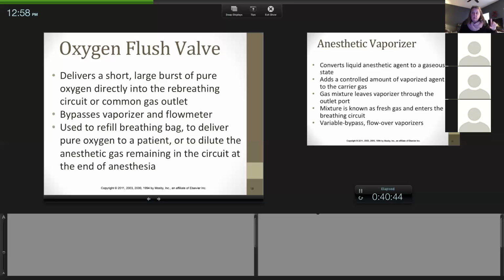And there's no excuse that on some off day, even if you have a half hour for lunch, you can't go into surgery when it's not being used and familiarize yourself with, first of all, where their emergency drugs are and how to use the anesthesia machine. Those are two things that I would do before I had to help in surgery, so that I know where they are. Like I said, at VCA in the prep room, we've got like 7 different anesthetic machines. They're all different, and one looks like it's from the 50s or something, but they all work the same way. So that's just my advice. Make sure you're comfortable with the machine before you actually have to use it for the first time.